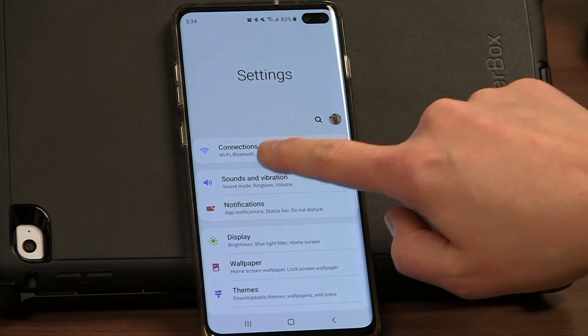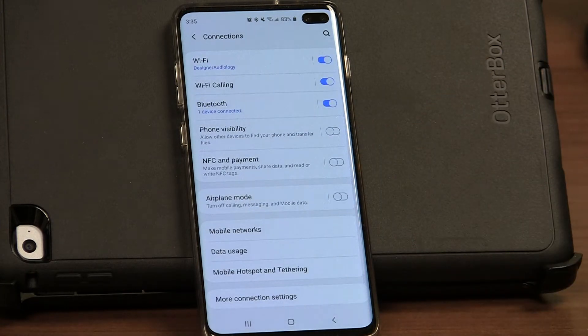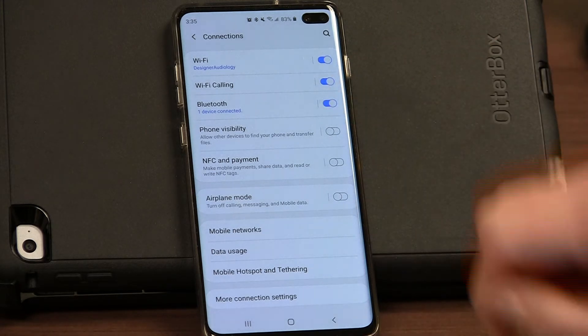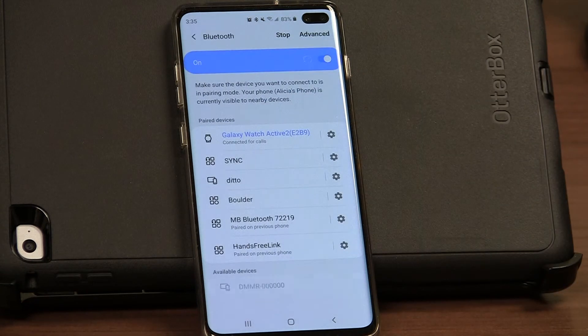The next thing we're going to do is find the Bluetooth option. On my phone it's under connections, and you can see Bluetooth is here. If it's not turned on, it needs to be. We're then going to click on Bluetooth and it's going to start looking for different devices.